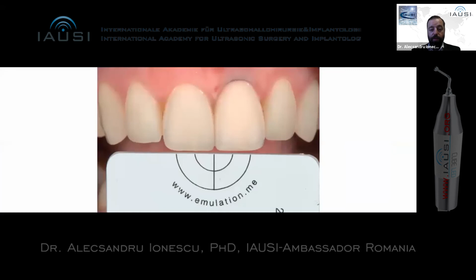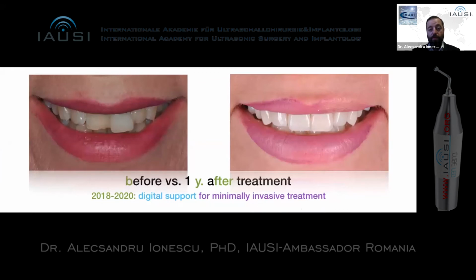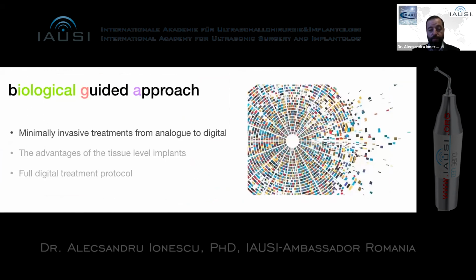This is how we do the color. And after cementation, you can see a slight irritation of the gingiva, and this is how it looks after 1 year. You can see that everything is very nice and stable. It's how the patient came and how we ended up with the treatment, of course, with the digital support in this situation.